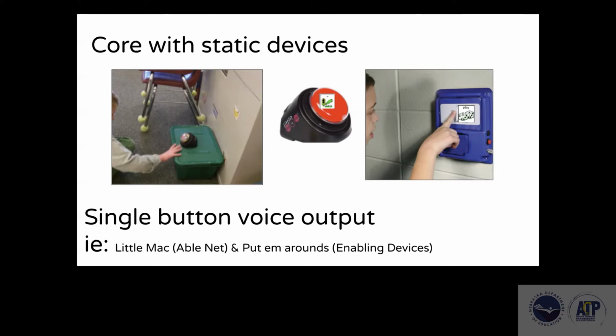And on the single voice output switch, we had the word play. And if he pressed it, it would say, can I play? And so he learned that when he walked over there, if he pressed that button, he would look at us, which we were so thrilled with, that connection and that communication. He would look at us and then we would open the box and he'd get to play.